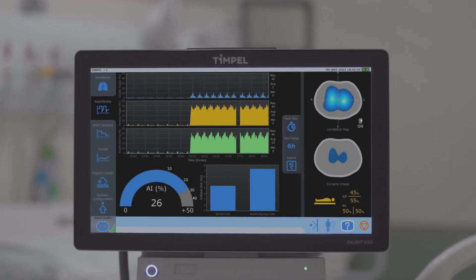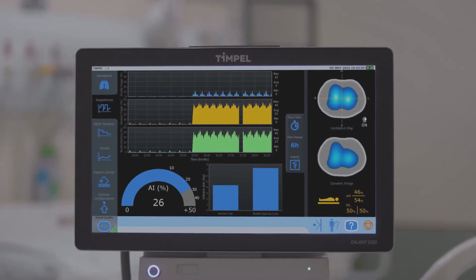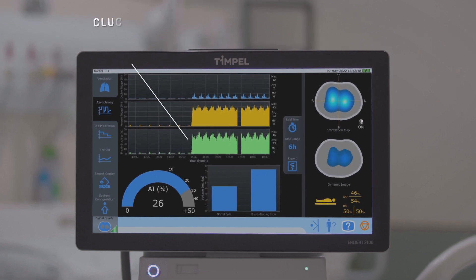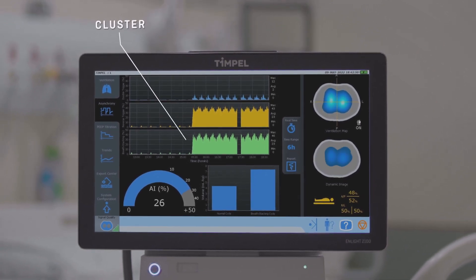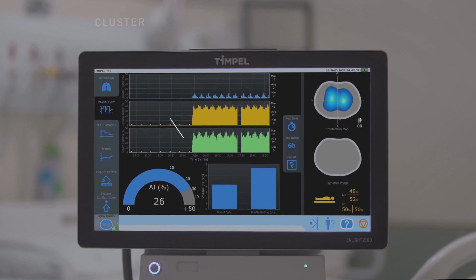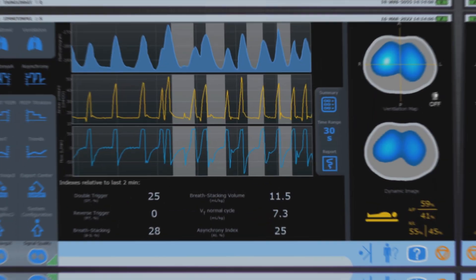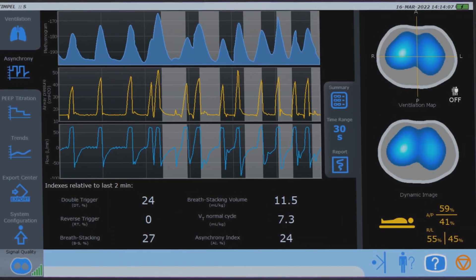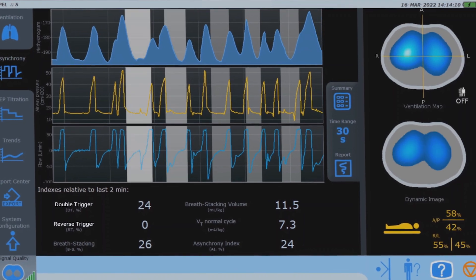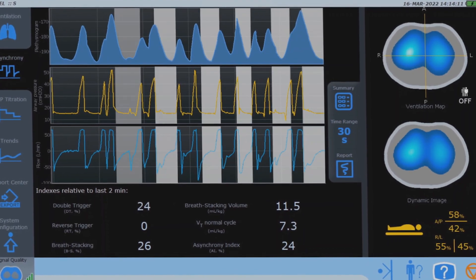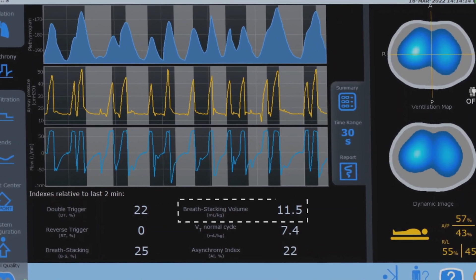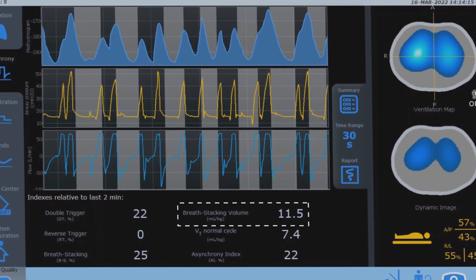InLight identifies patient-ventilator asynchronies in real time and tracks the occurrence of clusters, giving caregivers immediate feedback of how the patient is responding to the interventions. Breath stack cycles caused by double and reverse triggers are highlighted, and stacked volumes are quantified automatically at the bedside.